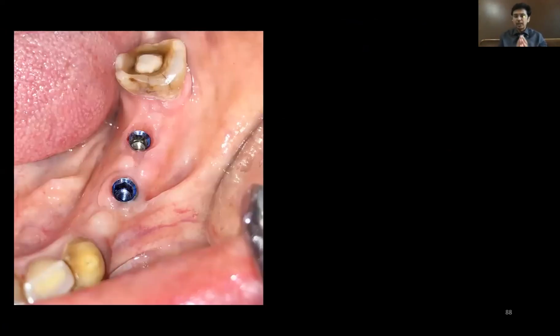With regard to impression taking, I always and always recommend the implant level impression only, not the abutment level impression. Abutment level basically means that we are placing an abutment, doing crown cutting just like the way we do for a normal PFM crown, and taking an impression. I never recommend that, because the beauty of an implant prosthesis is it should appear as if it is emerging out of the soft tissues. Are you getting the point? So with regard to implant impressions, always and always it should be implant level impression. That is the thing which you are supposed to remember. Now in implant level impression, we have two types of impression techniques.